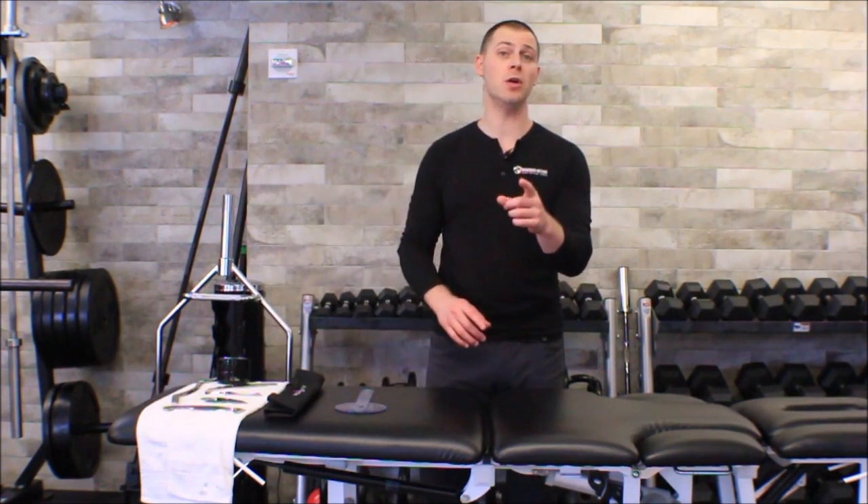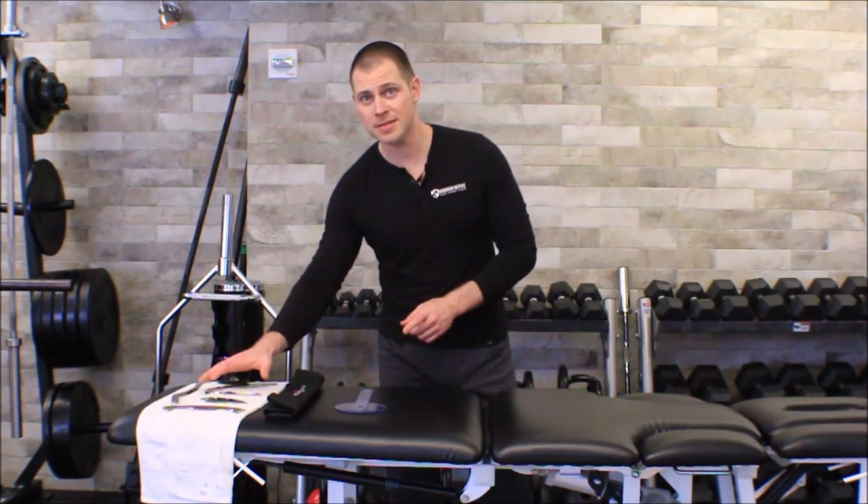This is Brent of the Brookbush Institute. In this video we're going over manual therapy techniques, specifically instrument assisted soft tissue mobilization. If you're watching this video, I'm assuming that you are a licensed medical professional with instrument assisted soft tissue mobilization within your scope of practice.